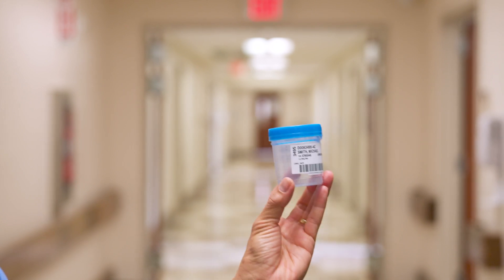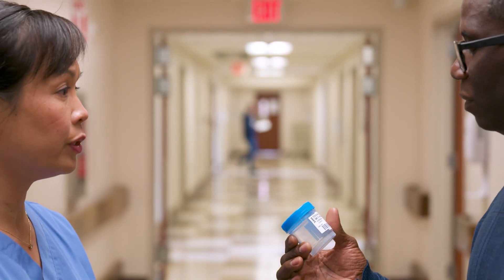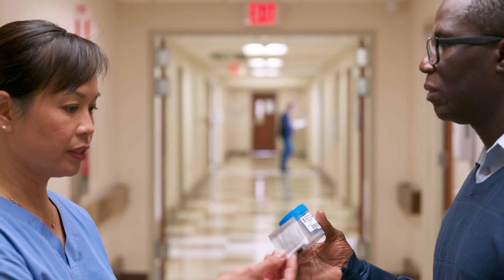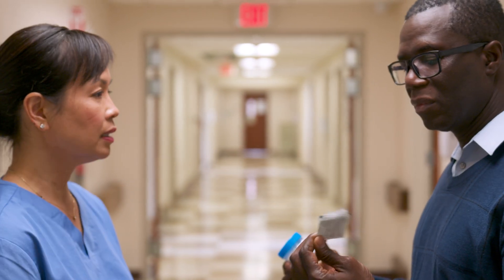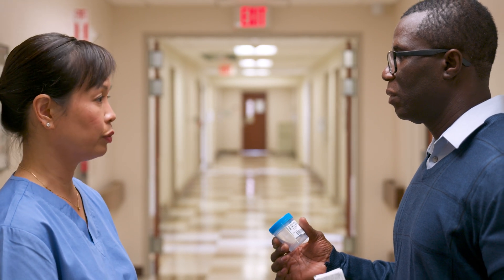It was a regular day in the hospital. I'm so sorry to hear that you're experiencing discomfort when you urinate. The doctor has ordered a urine test. Here are some cleaning wipes. Please clean around the urinary area. If there's foreskin present, make sure to retract it.